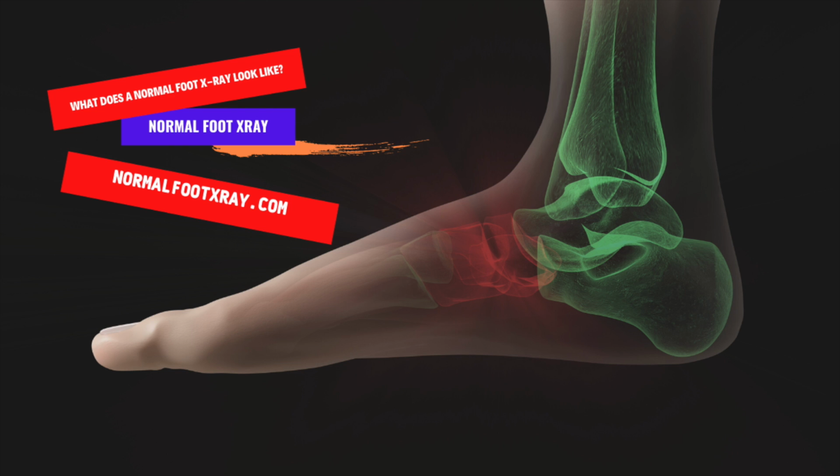An X-ray of the foot can reveal many different types of problems in a patient. In most cases, it will show the bones and joints of the foot. This information will be used to determine the correct alignment and healing of a bone. The X-ray can also help doctors plan a surgical procedure. If the problem is not obvious, it may be easier to detect. The foot shot can also help in detecting various types of tumors, cysts, or infections in the foot.